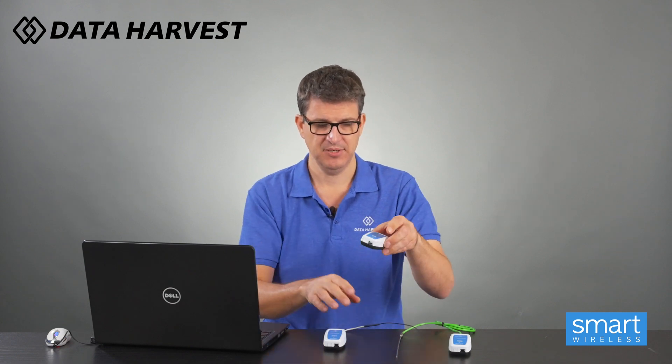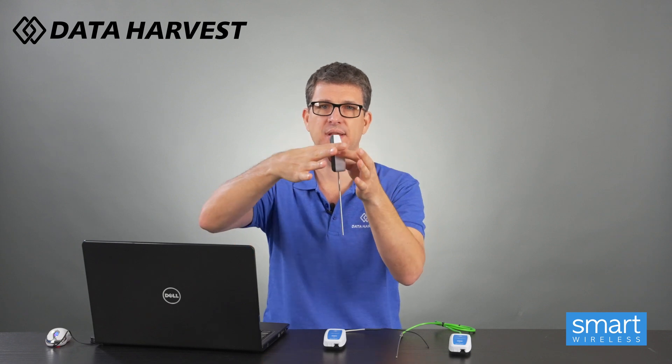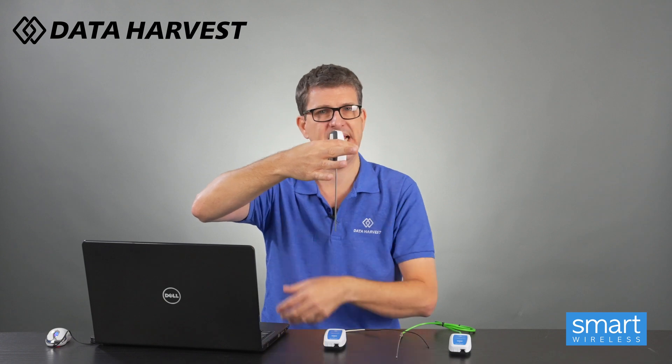Now the temperature housed sensor - because it's housed it can go in solutions, up to about a centimeter before the top. Normally this will go in a clamp on a retort stand - clamp, boss, retort stand, standard setup. It can go in. What's it used for? Anything you want a temperature change for. So any reactions will have a temperature change, i.e. titration.